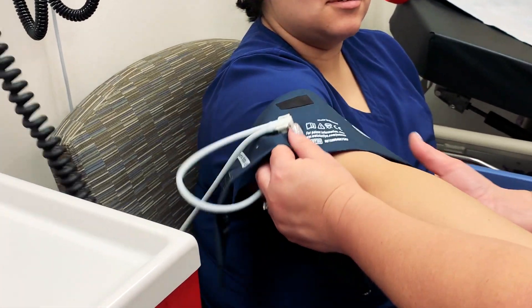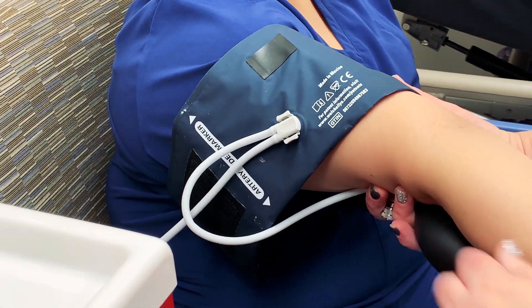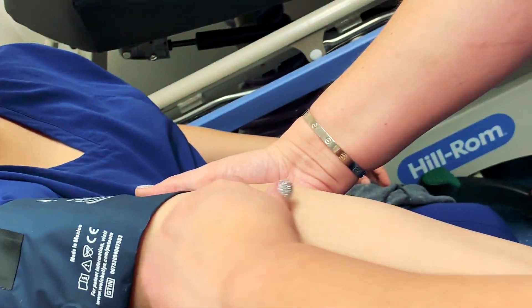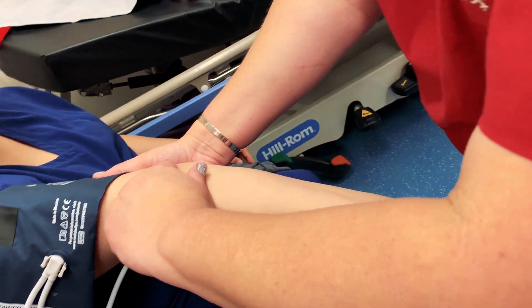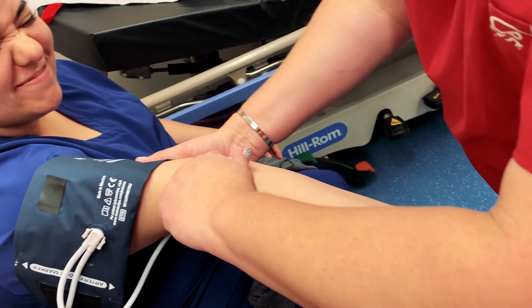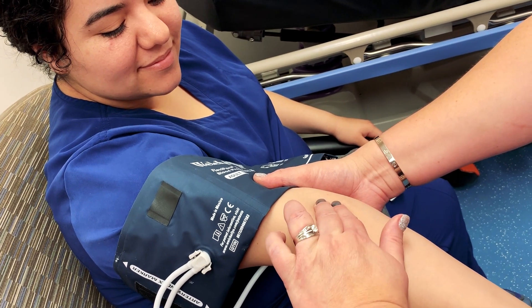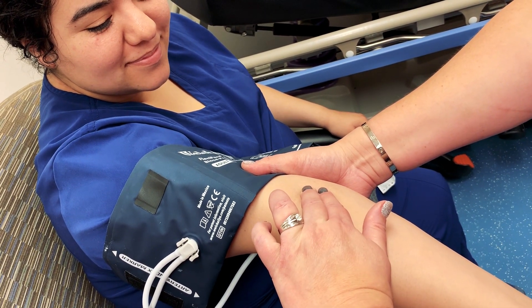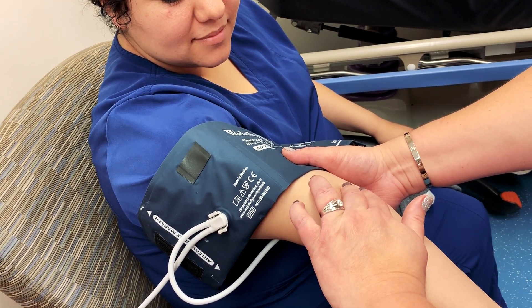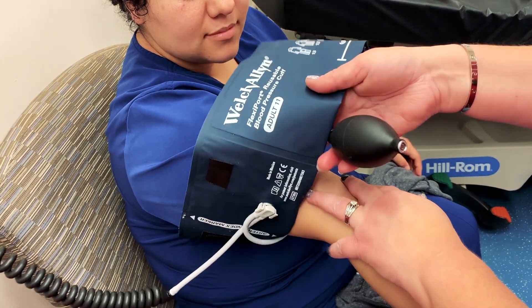You want to go up from the patient's pinky and follow it up to locate the patient's brachial pulse. Feel for the bounding pulse — and there it is. That is where we are going to place the cuff.